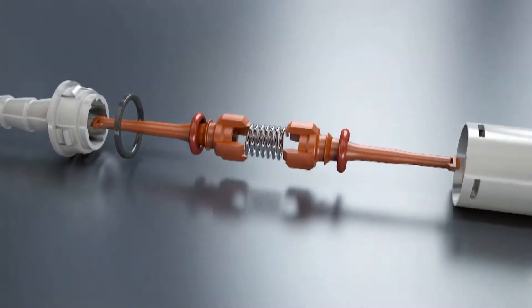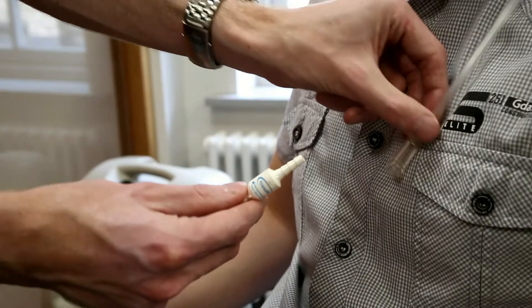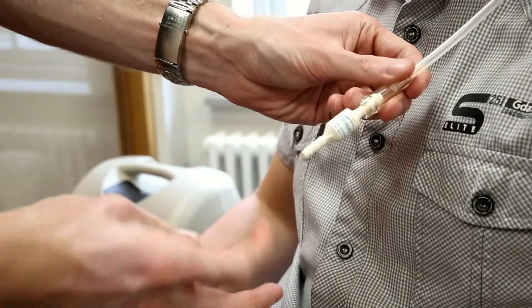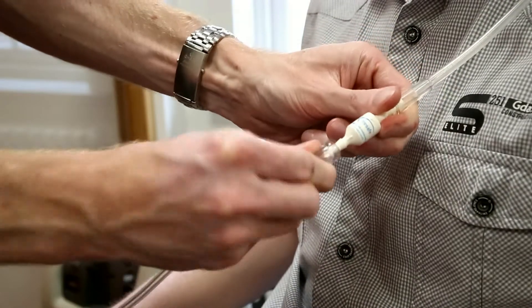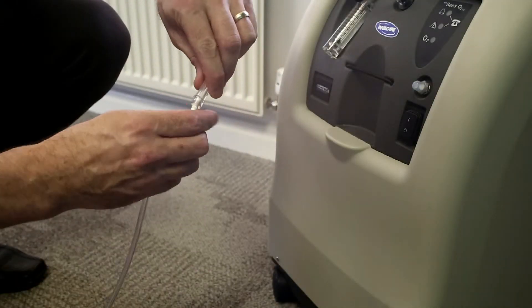Fire brakes satisfy both requirements. For optimal protection, at least two fire brakes should be installed in the supply tubing. One should be fitted close to the patient and one close to the supply.